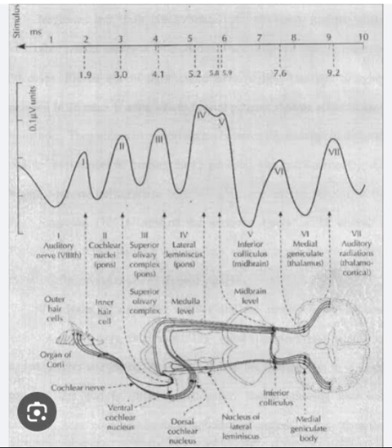Recording parameters. Several recording parameters need to be considered when conducting a BERA exam. These include the amplification, filter settings, and sampling rate. The amplification determines the sensitivity of the recording, while the filter settings help remove unwanted electrical noise. The sampling rate determines the temporal resolution of the recording. Setting appropriate recording parameters is crucial to capture the desired frequency range and minimize artifacts.